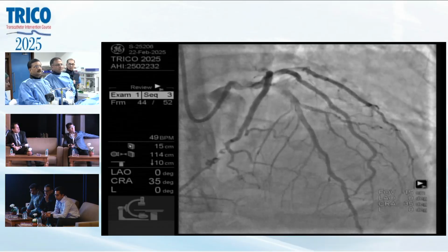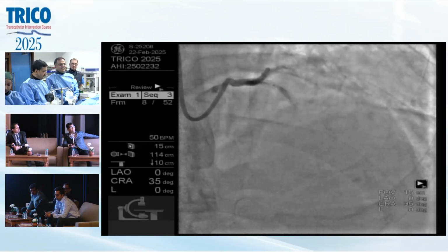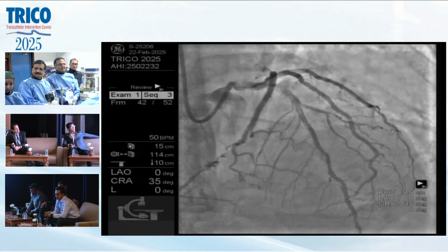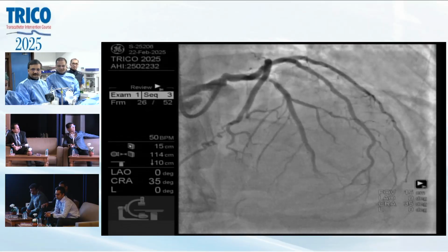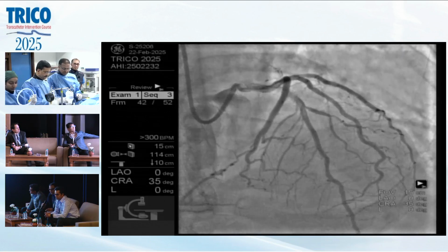We're going to go with the old school and just dilate first. There's no penalty to dilate here anyway. We're probably not going to dissect anything with a 2.0 balloon. Even if we want to do atherectomy afterwards, it'll be okay. Sounds great.